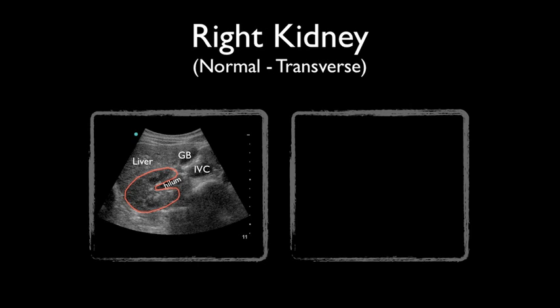The renal cortex and pyramids are found on the periphery of the kidney and appear grainy. The central area of the kidney, the renal sinus, will appear bright and consist of the calyces, renal pelvis, and renal sinus fat. It is a good idea to always scan both kidneys for comparison. Ureters are usually not well visualized with ultrasound, but when distended, may appear as tubular structures extending inferiorly from the kidney.